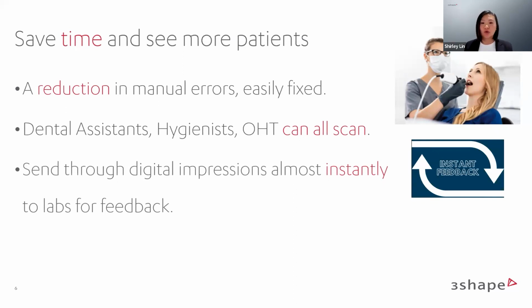Send through digital impressions almost instantly to labs for feedback. So just again, you can send your digital impressions straight away to the labs. Using your conventional impression techniques, you can wait until the next day or even a few days for the case to reach the lab, and then they come back to you with feedback, letting you know, oh, actually, your impression's not good enough, you might need to re-prep, and then having to bring that patient back in, where instead of doing that, you can send it straight away to your lab.